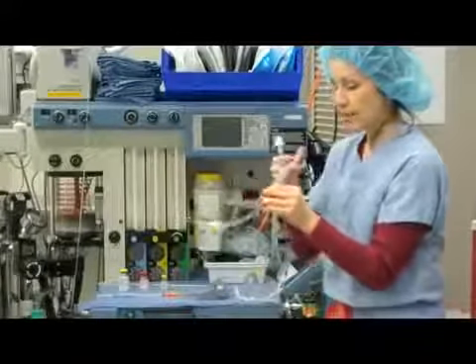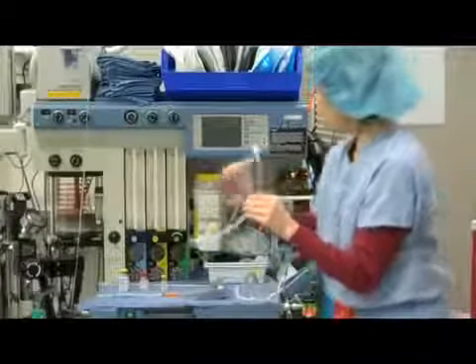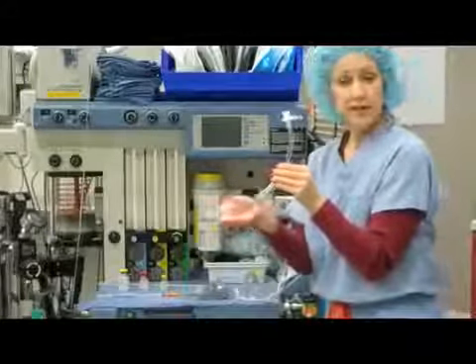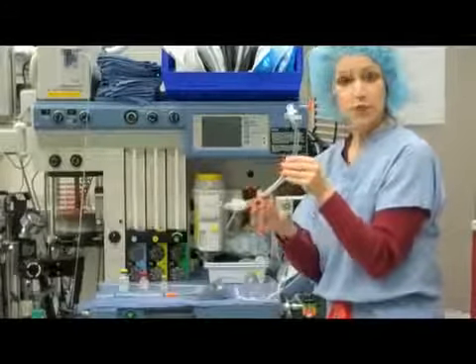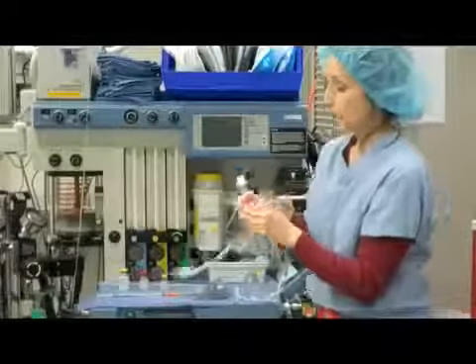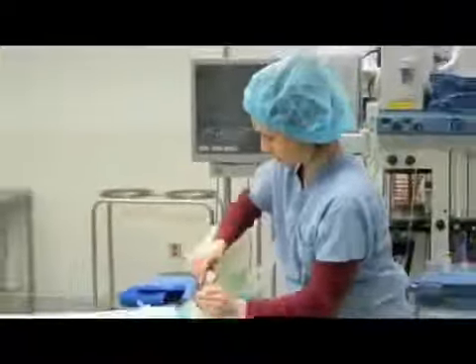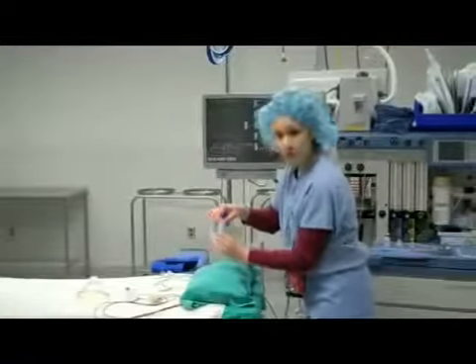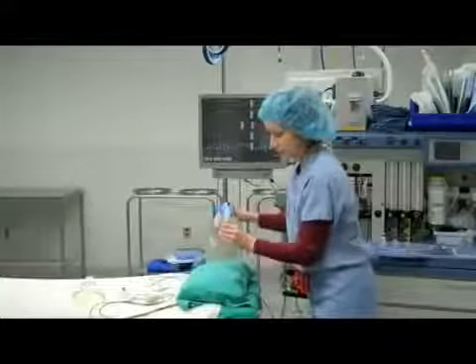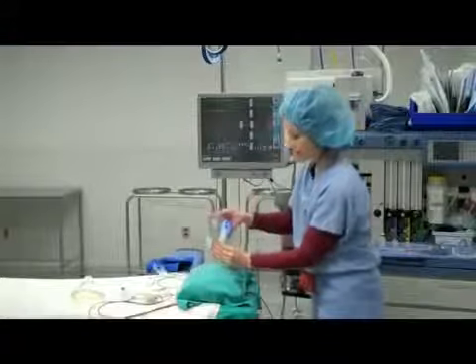We inflate the cuff that sits at the end of this breathing tube. So now this cuff is inflated and it is sitting inside the patient's trachea, so the breathing tube won't move. Okay? So what I'm going to do is attach this breathing tube onto the circuit here to demonstrate how, once this breathing tube is in, we then go ahead and manage the patient's general anesthetic.